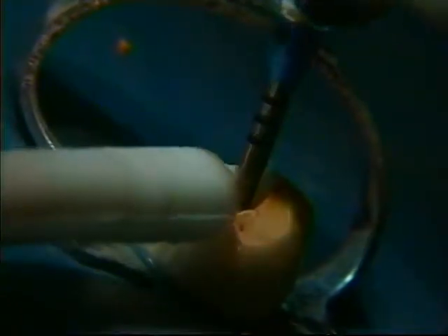With sufficient space created, a Profile 30.06 is introduced alongside the carrier at 300 RPM. The instrument is removed frequently throughout the retreatment procedure, and gutta-percha debris is cleaned from the instrument as well as the canal space.